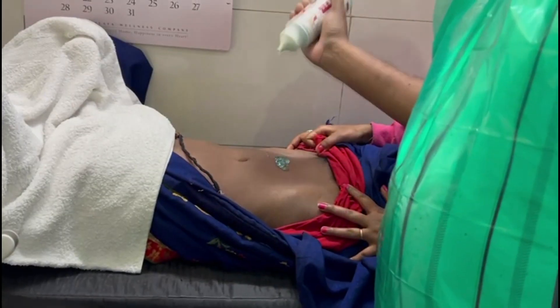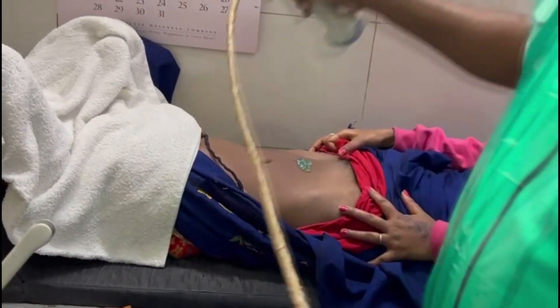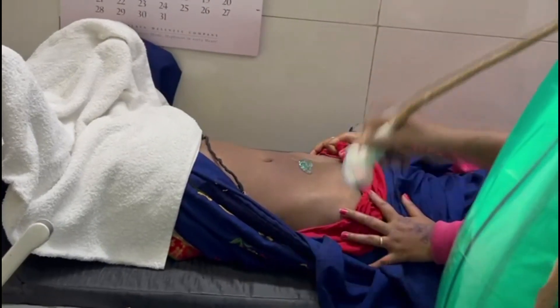I guess it will be a very small baby. I am putting the gel over the lower abdomen and I am placing the probe over the lower abdomen.